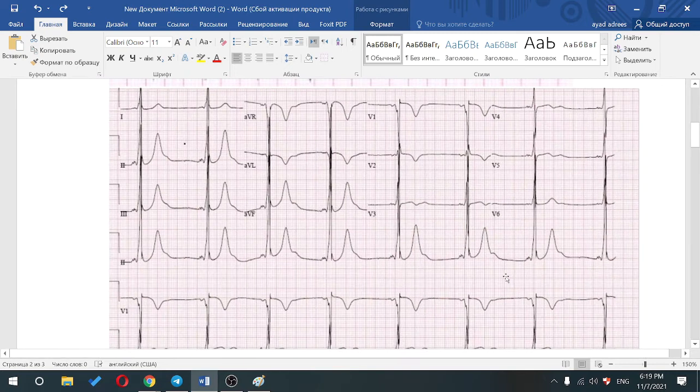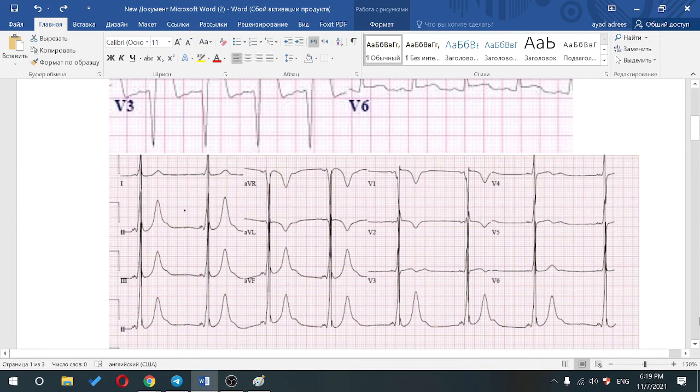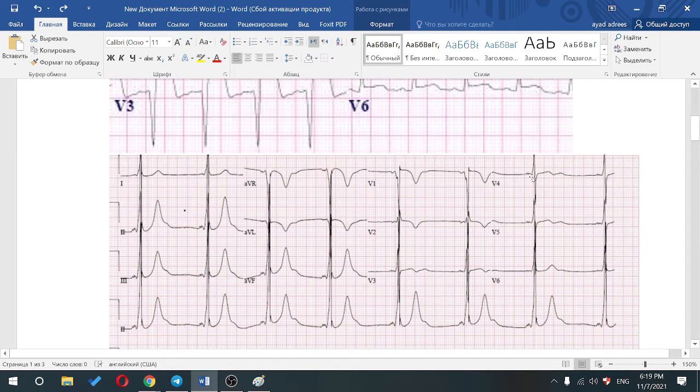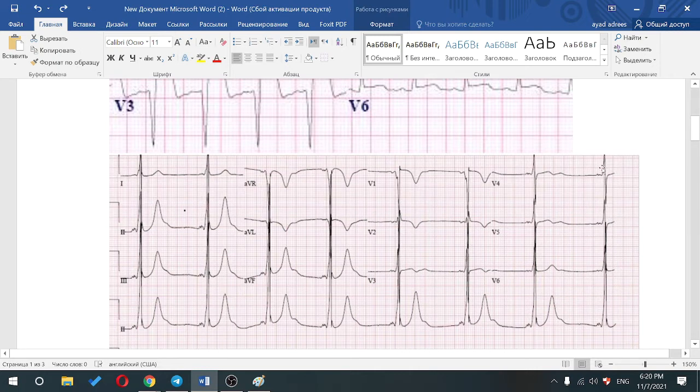Now, is there an atrial enlargement? Let's take a look. Atrial enlargement, oh man. Well, my question to you: is there a ventricular enlargement in this patient? This is not for the USMLE, this is just for you guys. When you take a look at the ECG, just look at the R wave. It's more prominent at the lateral wall. So what makes up the lateral wall of your heart? Is it the left ventricle or the right ventricle? Left ventricle. And the R wave is ridiculously high in the lateral leads, so you start thinking about left ventricular hypertrophy. So keep that in mind.